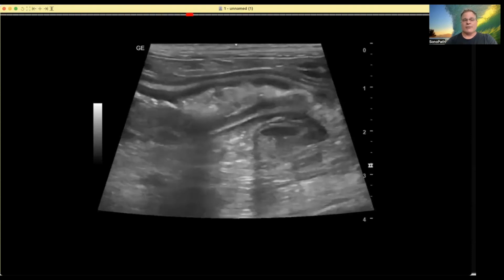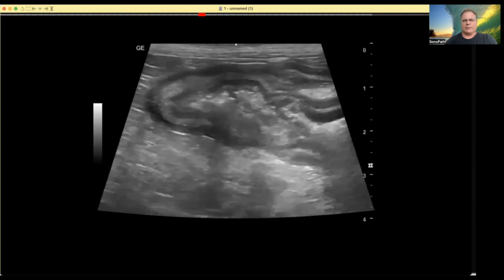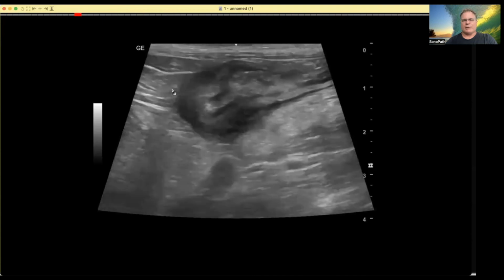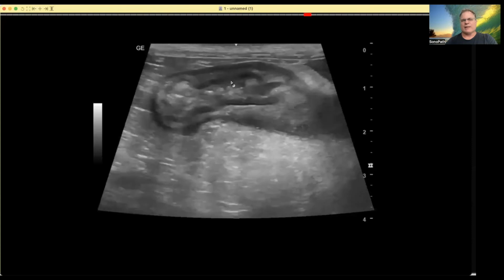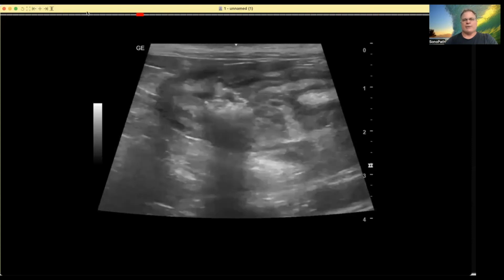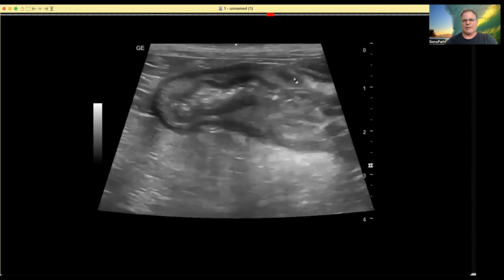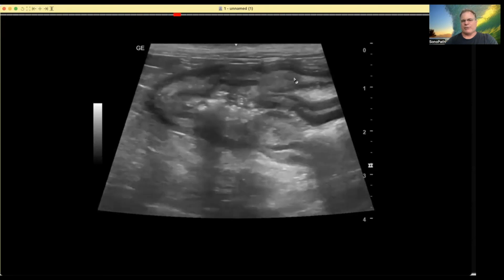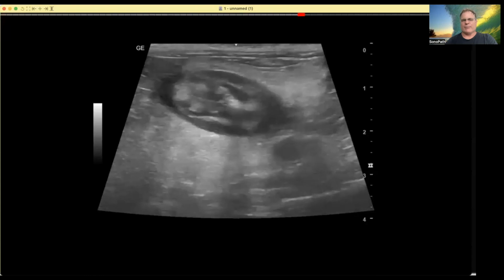Possibly. And this is why when you get this out onto the surgical table or in a prep area where you can biopsy, you want to take your probe and do ultrasound right on the bowel and look for the areas that lose mural detail where that submucosa is disrupted. You see how thick this submucosa is, but it's still intact in this portion of bowel. But there are other portions where you're starting to lose it, like here. So this is the area you want to biopsy, because that's the worst case scenario of what's going on in this bowel. And so I would send in multiple samples on this.